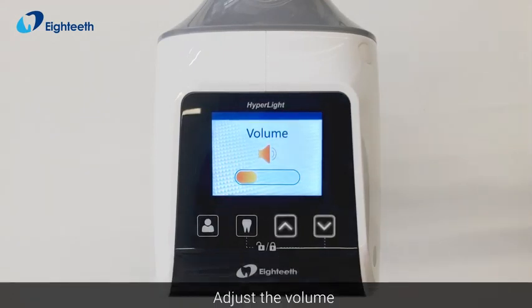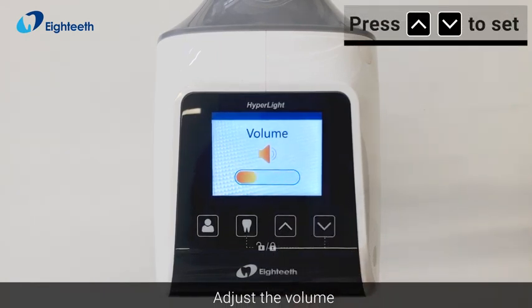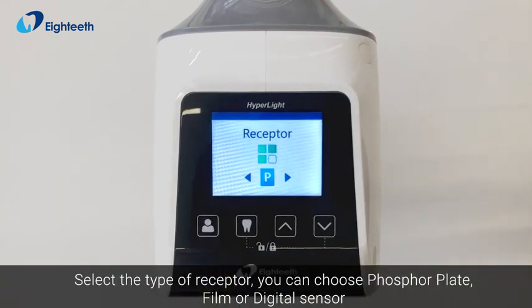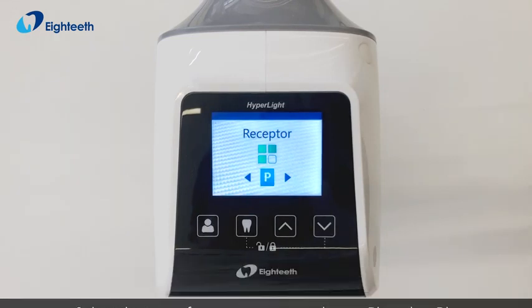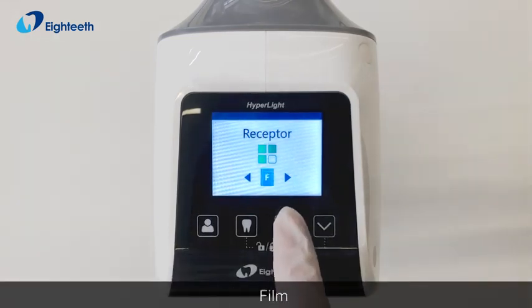Adjust the volume. Select the type of receptor — you can choose phosphor plate, film, or digital sensor.